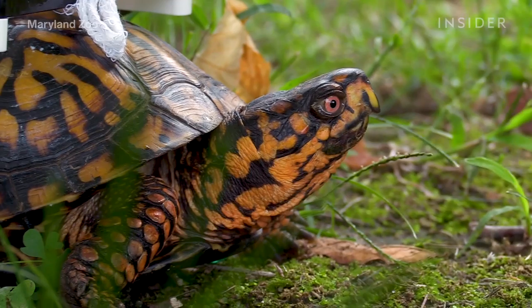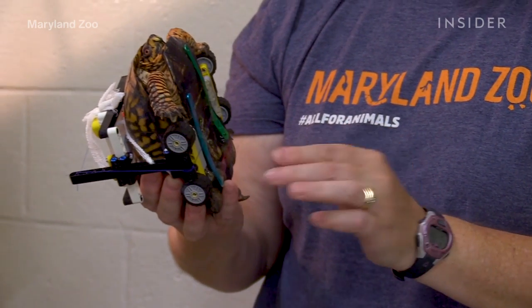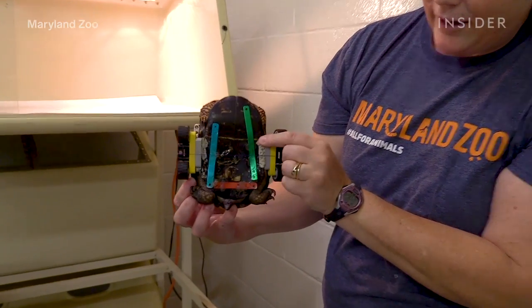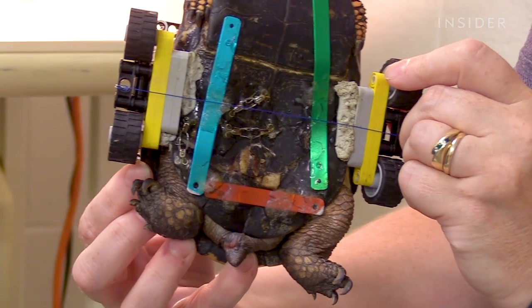This guy was an interesting case because it was the opposite side of the turtle that was fractured. Normally it's their back that's fractured, and unfortunately no one makes a turtle plastron fixating kit.